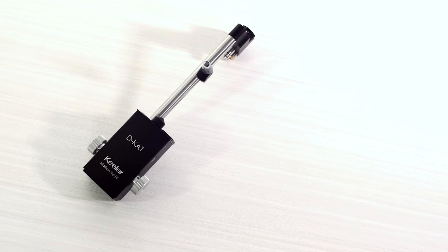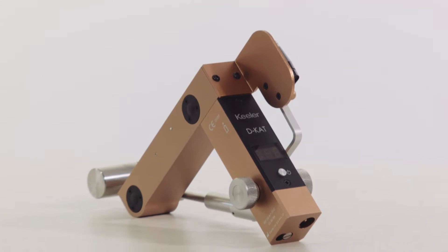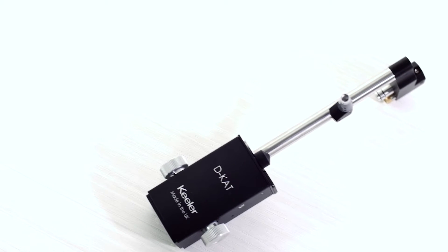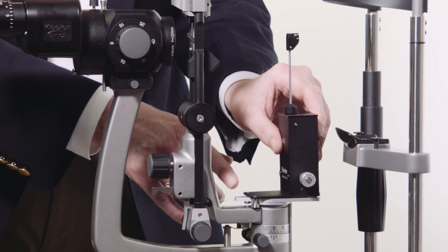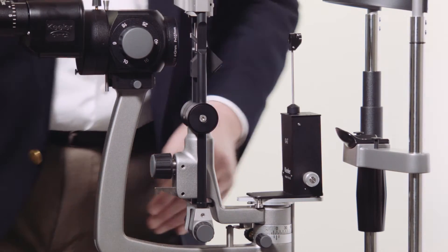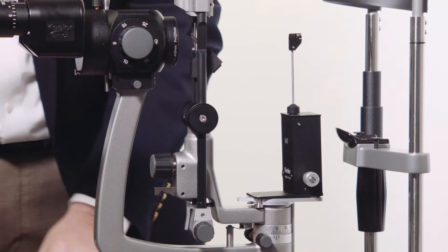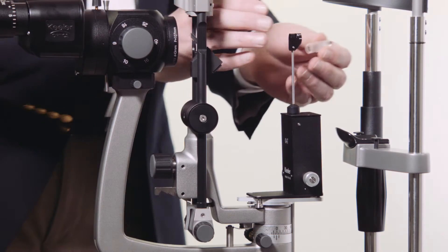The Keeler Applanation Tonometer Series uses the widely acclaimed Goldmann Applanation Principle to directly assess intraocular pressure by measuring the force required to flatten a constant area of the cornea. The advantage of using a Goldmann-type tonometer is that IOP can be measured during routine examination with a slit lamp. There is no calibration necessary and standard deviation between measurements is low.